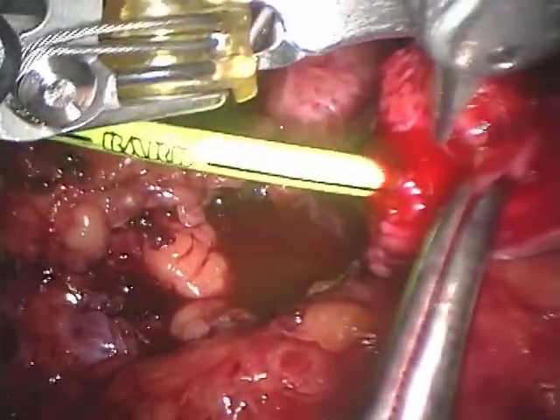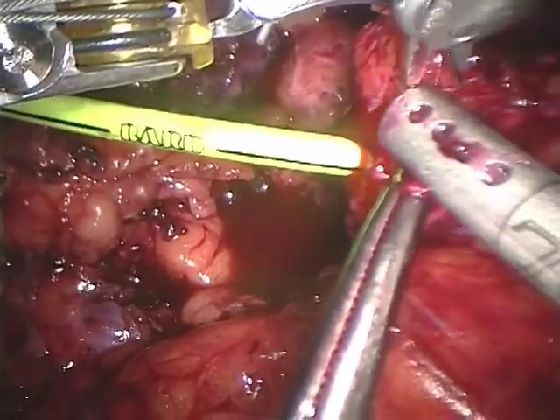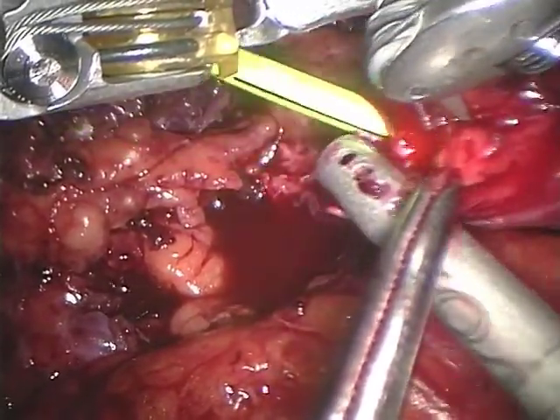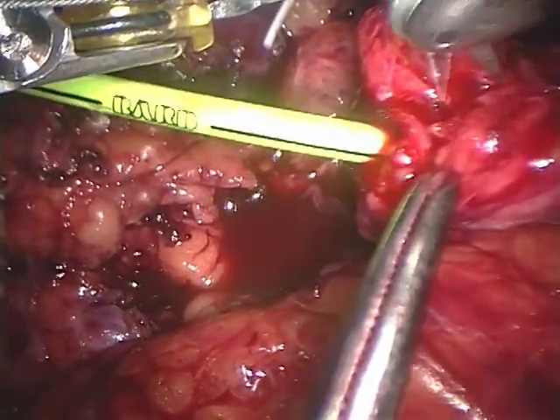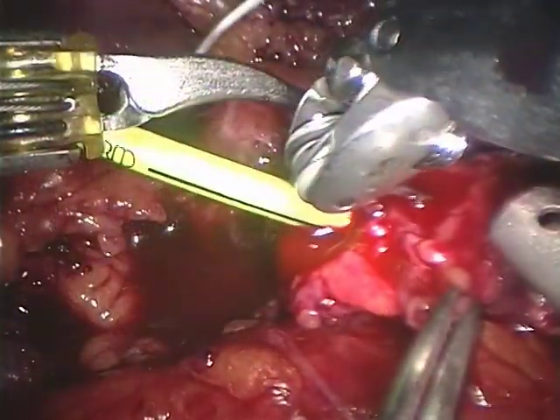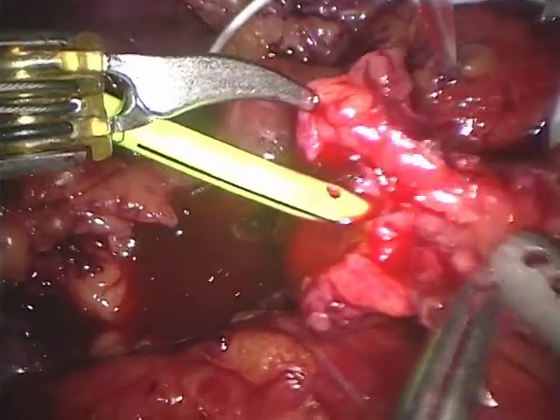A Maryland dissector is used in the left hand and pot scissors in the right. At this point, the ureter is being freed from all the fibrosis and is spatulated, preparing it for the ureterocalycostomy.